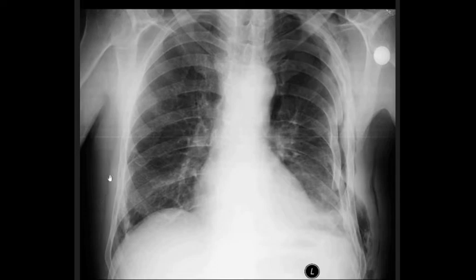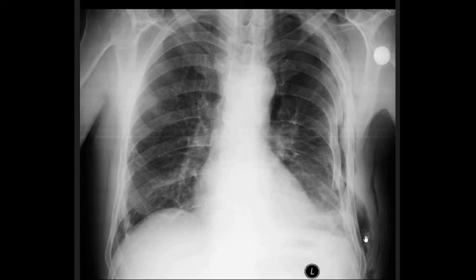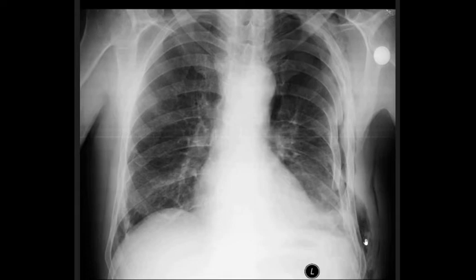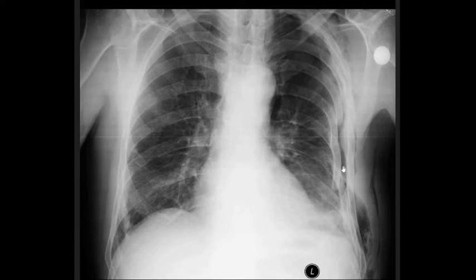Also interesting on this X-ray: looking at the subcutaneous tissue near the skin, there is a blackout of the normally whitish tissue — this is subcutaneous emphysema, which is air in the subcutaneous tissue. If you pressed on the skin you would feel a crackling sensation. This can result from the lung or external trauma. Subtle pneumothoraxes require careful attention so they are not missed.